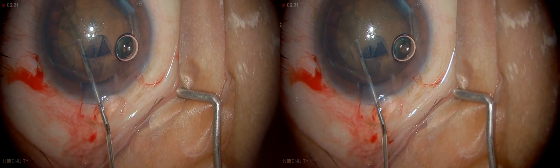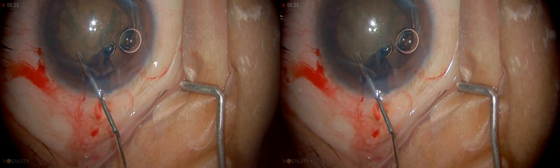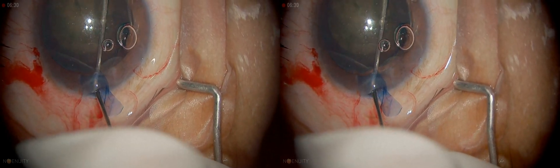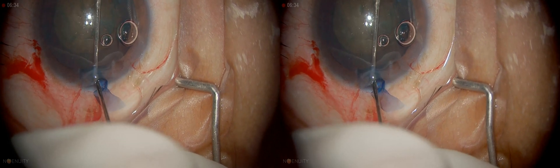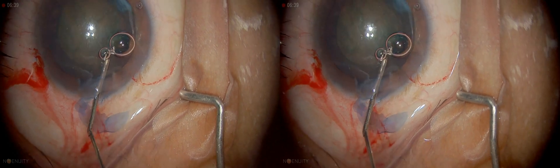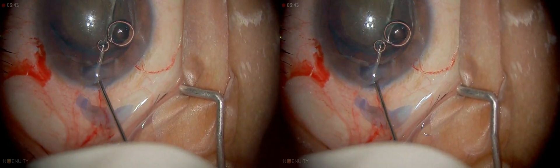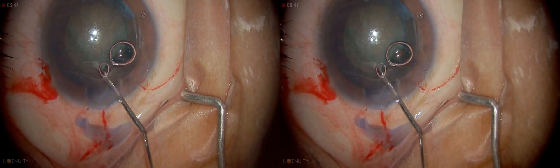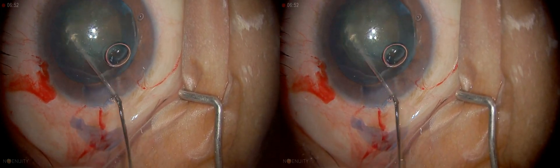Once that is done, test to see whether rotation is there. If not, the procedure may have to be repeated. So just going to repeat this again on this side as well. Now it is free and rotatable.